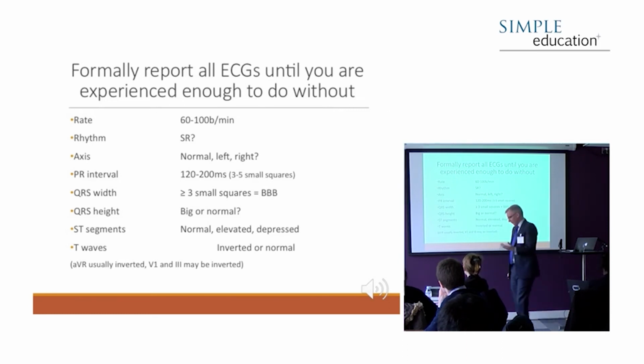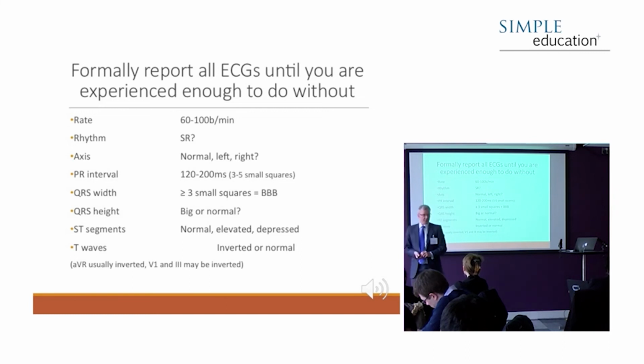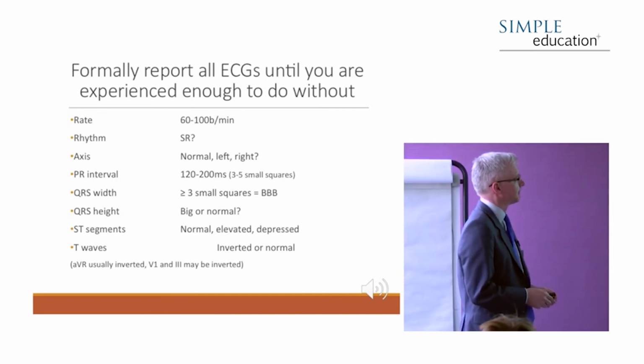And atrial fibrillation is very important because it's responsible for 1 in 4 of all strokes, and they tend to be big strokes. It's very easy to treat and reduce this risk with anticoagulation. And then the final one is, have you got any emergency rhythm? So broad complex tachycardia. You're going to immediately look and establish whether you need to instigate emergency management. Broad, fast, regular rhythms. Think ventricular tachycardia, which is dangerous. It's an emergency rhythm that needs emergency management.